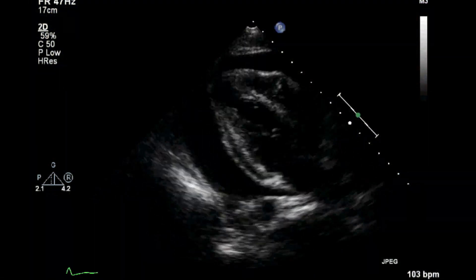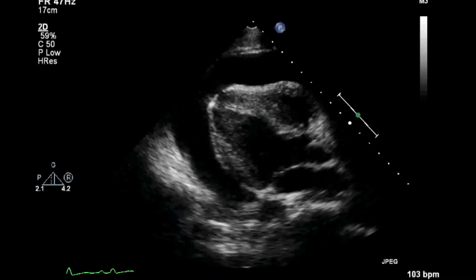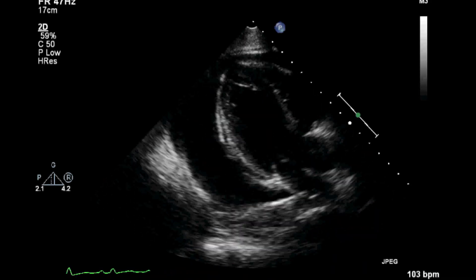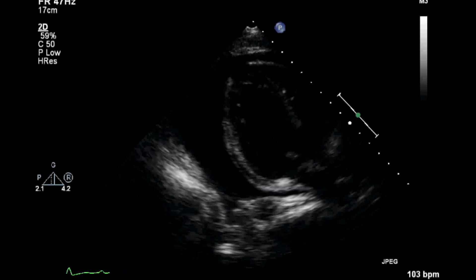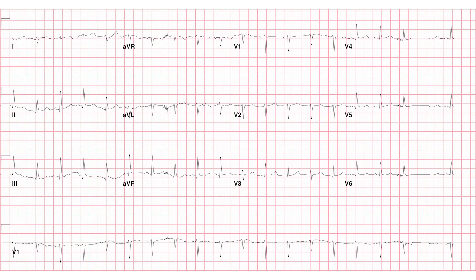Notice the large volume pericardial effusion present on this ultrasound image. The heart is swaying back and forth inside of the pericardial sac, contributing to the finding of electrical alternans seen on this EKG.